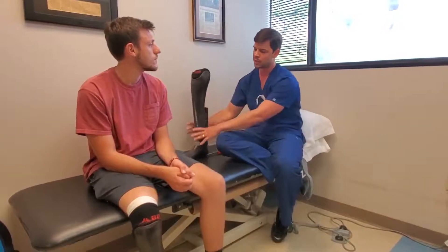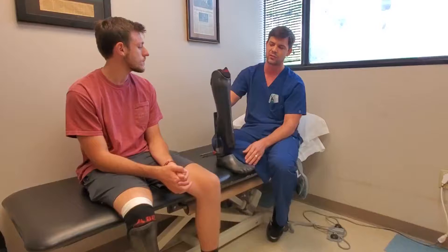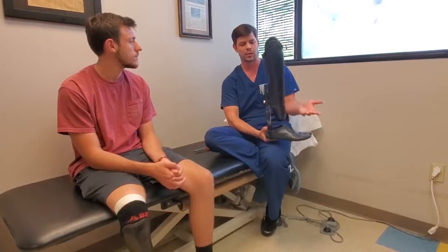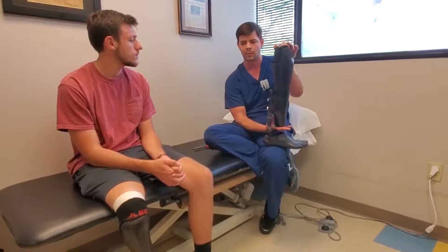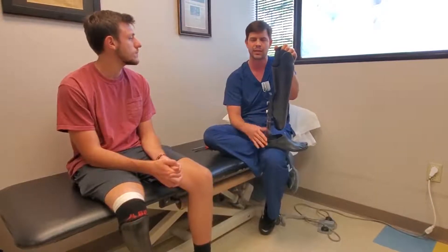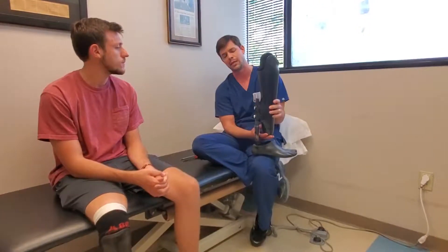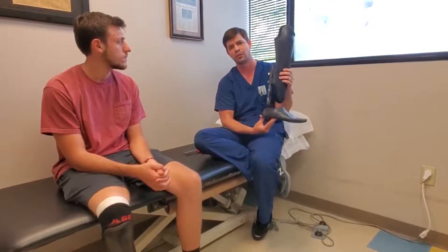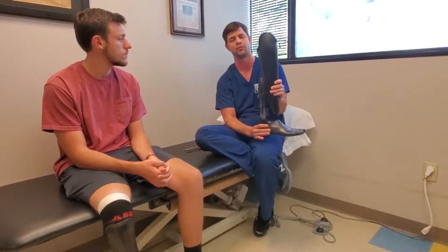He came to us with a conventional type of prosthesis that had a large cosmetic cover over it, held on with a suspension sleeve. Before he got this leg, he was transitioned to a posterior mount foot. This is an Ares performance foot — it's a good smooth walking foot and allows for a lot of clearance. Alex has a long residual limb; he has a Symes amputation, so sometimes you don't have clearance for a good foot distally. What we do at ABR is a posterior mount so patients can have a higher-functioning foot without worrying about clearance. He's been using this walking foot for several years.